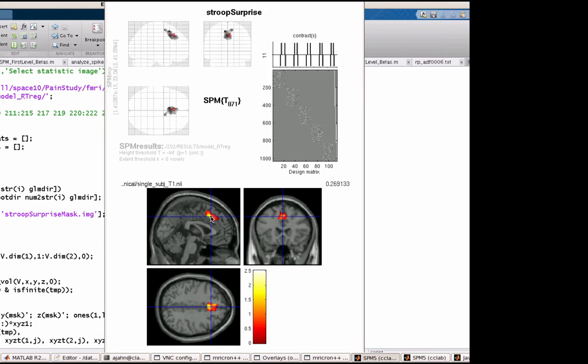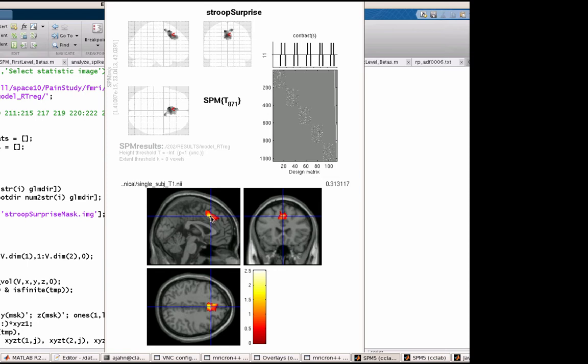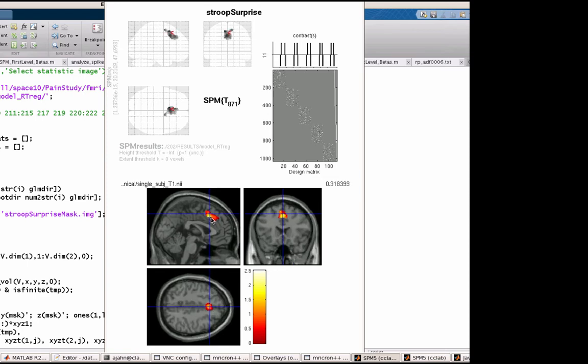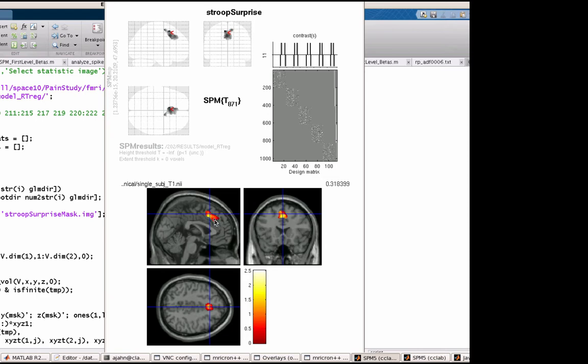It's a main effect across both pain surprise and stroop surprise, collapsing across modality, just looking at surprise. So this is just a visual of what it looks like. I've just used that ROI, loaded it up, set the p-value to one. These are all the voxels that are activated. So that's what I'm using for my stroop surprise mask and then a similar process for my pain surprise mask. And how I got those, not to get too far off the beaten path, but I just multiplied that stroop surprise contrast map across the whole brain and multiplied it by that binary mask, collapsing across both stroop surprise and pain surprise. So if you're cool with that, if you have any questions about that, you can send me a quick email or something, but that's how I got it. That's what I'm extracting.